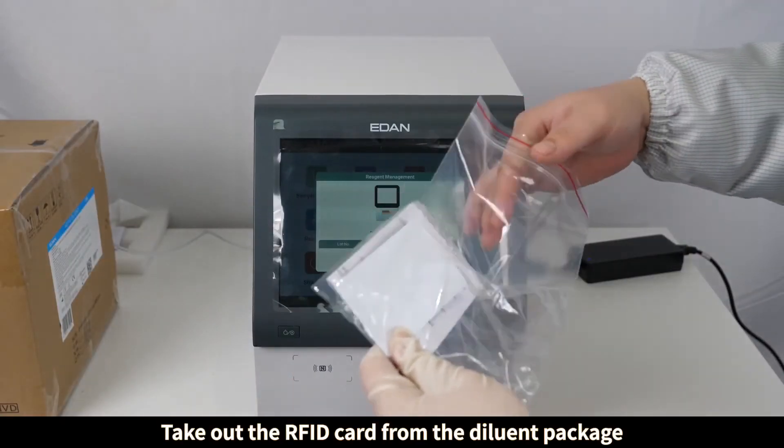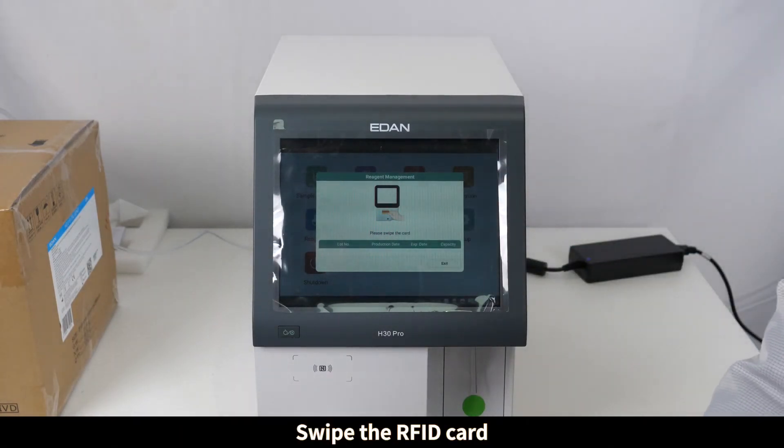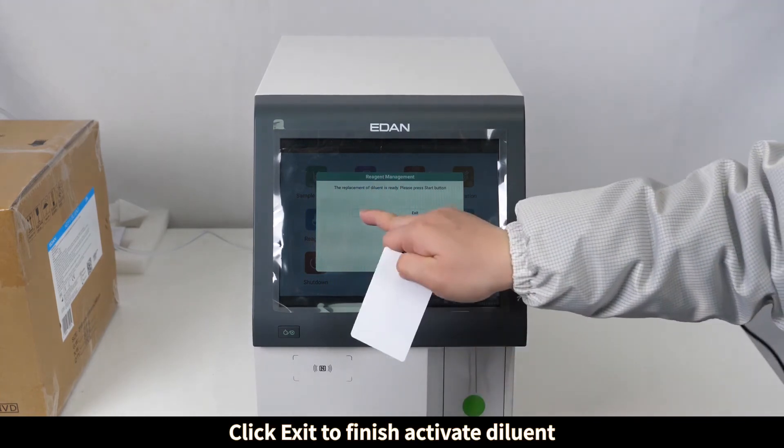Take out the RFID card from the diluent package. Swipe the RFID card, then click Exit to finish activating the diluent.